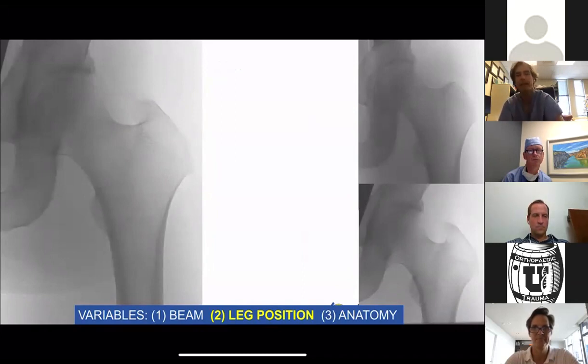I have to admit, I didn't understand this very well, and I was in a session with some people who are really good hip surgeons, master hip surgeons, and they were talking about malreductions, and Keith Mayo piped up and said something about the shape of the proximal aspect of the neck and why it was like that because of the malreduction. So looking at AP, you had the ability to judge the sagittal plane.